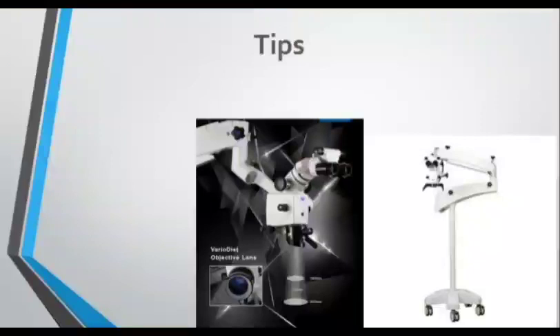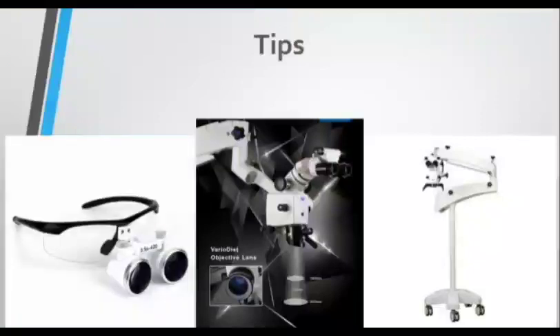I believe any tips and tricks about dentistry in general and especially endodontics should start with magnification and illumination. And in order to make it a practical tip, not all about expensive tools that many dentists are not able to purchase, we can modify this tip from magnification necessity into seeing necessity.